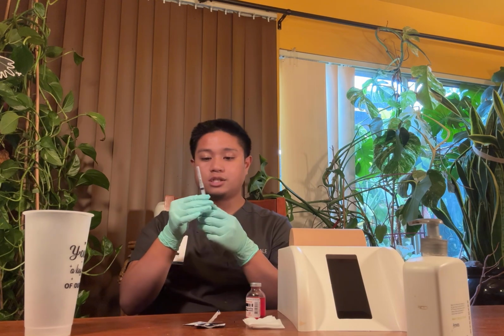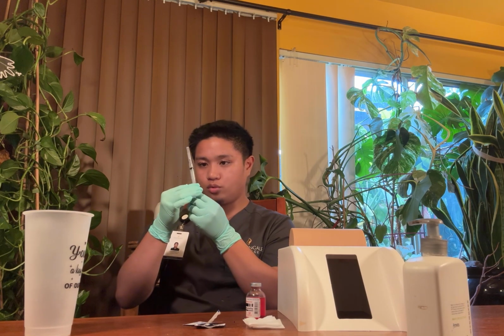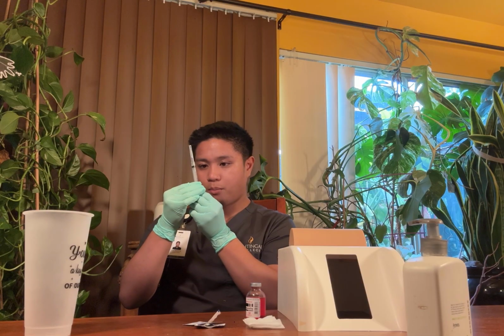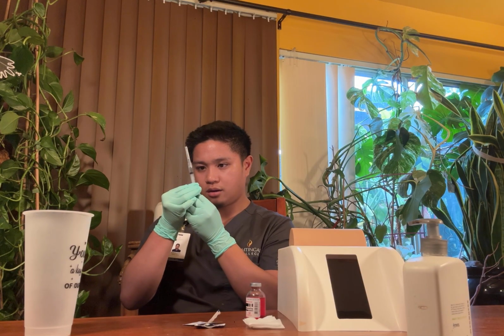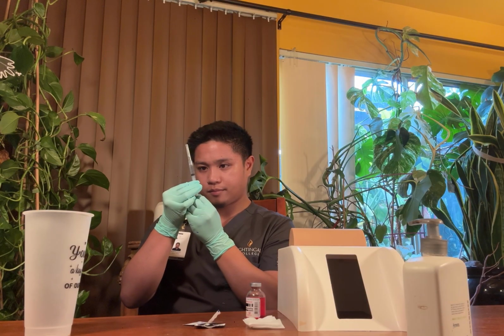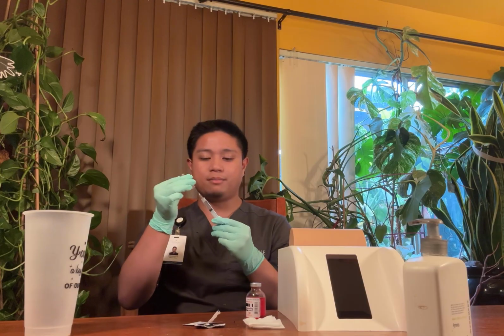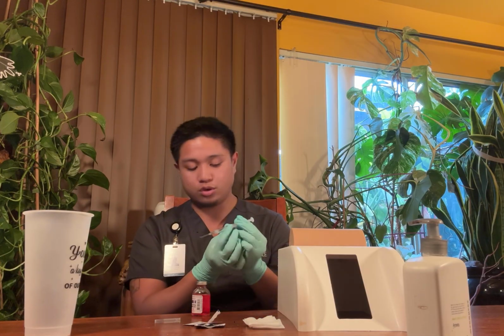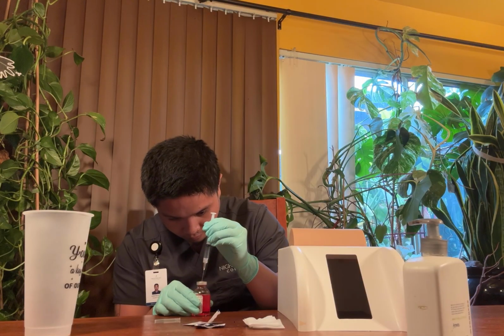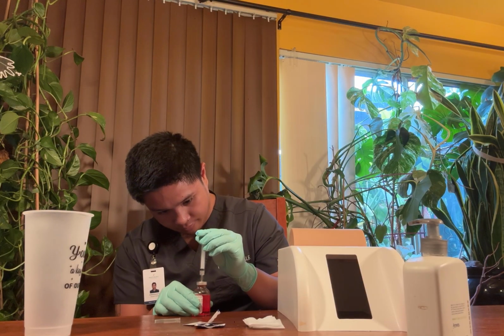Now that it's attached, while the cap is still on, I am going to draw 1.5 milliliters of air. And now that that has been completed, I'm going to remove the cap, place that down, and then inject it into the morphine sulfate. I'm going to inject the air in.